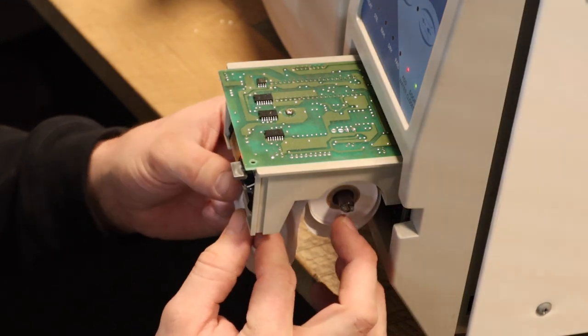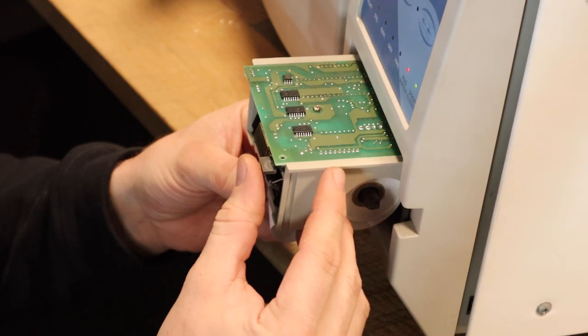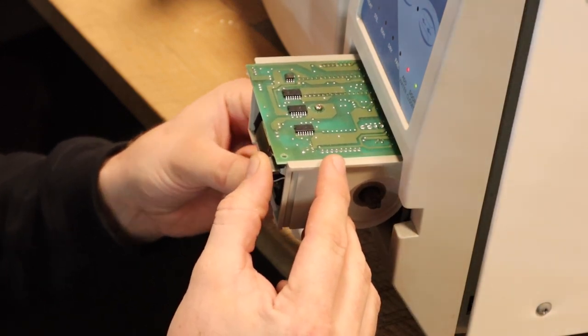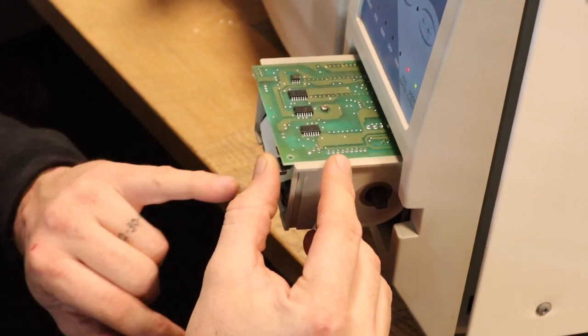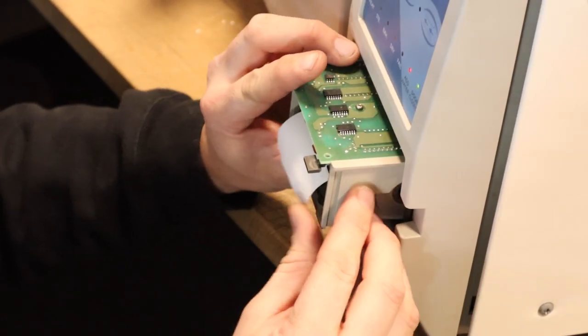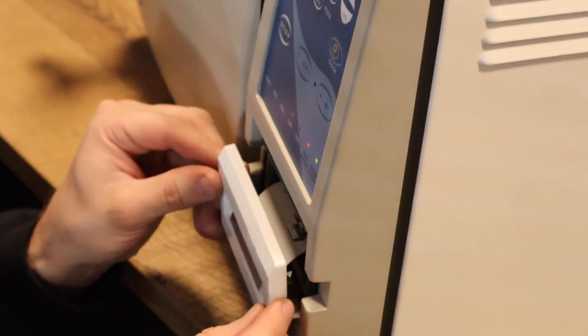We're going to take the paper and slide it up in. As you notice, the paper light goes off, and we're going to assist the paper upwards while holding the feed button. You'll notice paper starts coming out the front. Once it has came out the front a little bit, you can push the printer back into place and slide your cover back on.